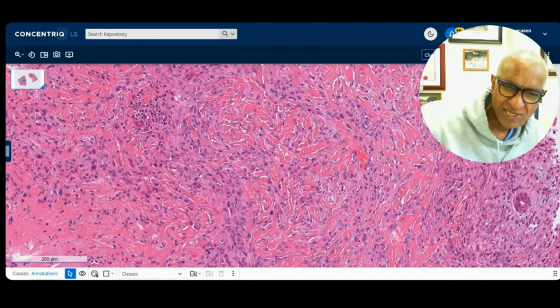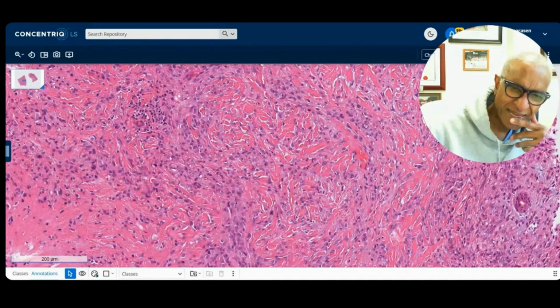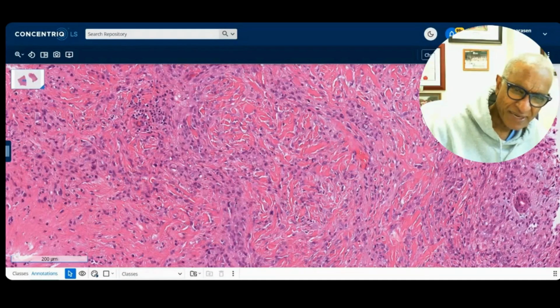But if you go back to the literature, about 8-10 years ago, Dr. Markku Miettinen from NIH, now at the Armed Forces, wrote a paper showing that 60% of epithelioid sarcomas are ERG positive. So that was the reason I gave it to you. I apologize for the confusion, but you were asked for that and I had to give it to you. So be careful, because if you're thinking vascular and you do CD34, 31, and ERG, you probably get two of them positive as well. Just something to be wary of.